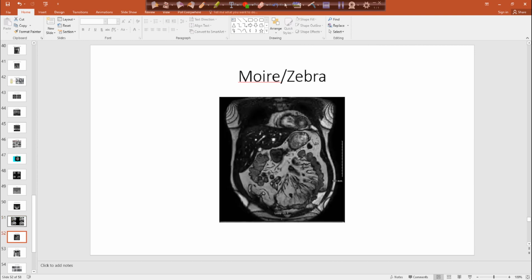All right, zebra. Obviously, the name kind of gives it away, right? So you get these areas where it phases in and out. Remember that in and out imaging where we got those dark bands that surrounded the organs? Well, what's happening is this is a combination of that in and out, because this is a gradient echo, very fast pulse sequence.